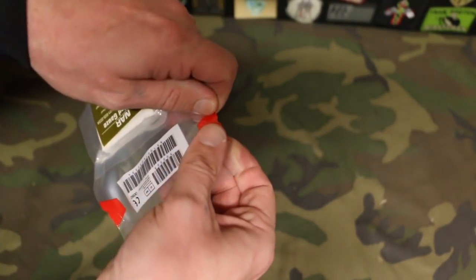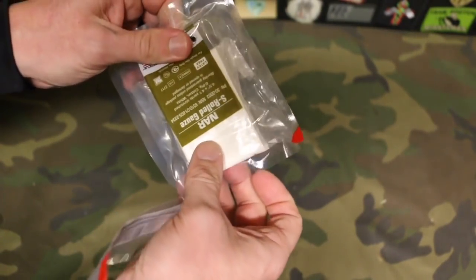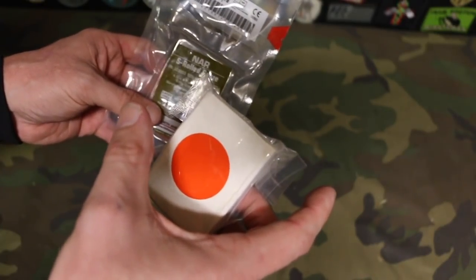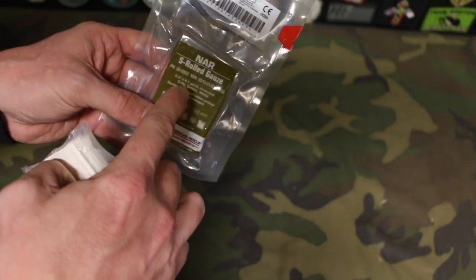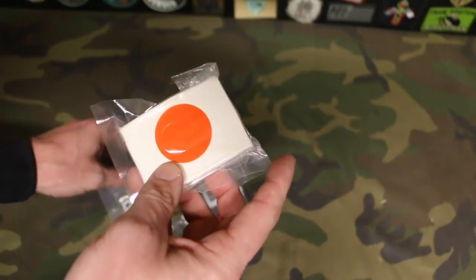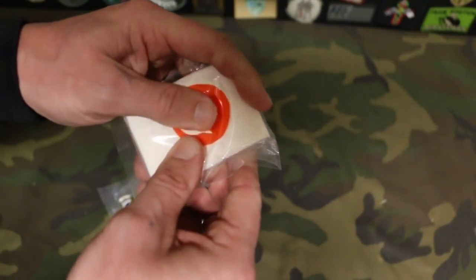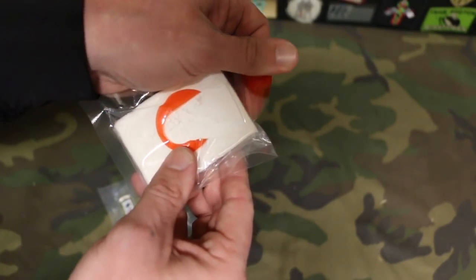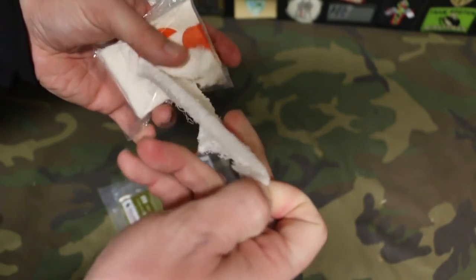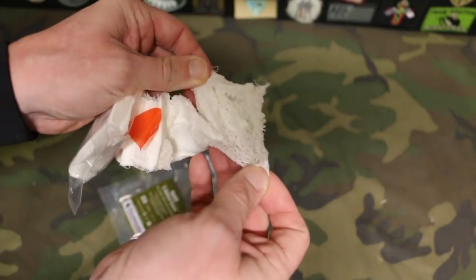So we can pull here — that opens up the packaging. This gauze, when it comes out, is going to be four and a half inches wide and a little over four yards in length — specifically 4.1 yards. Now we have this package open. If you pull right here on this little red dot it comes open, and now we can start pulling out the gauze, and it's going to kind of feed out of the packaging.